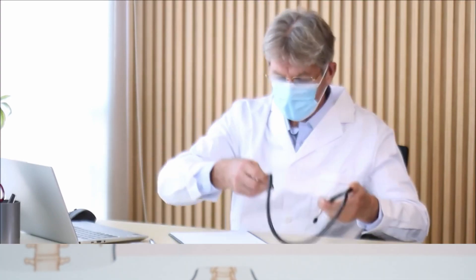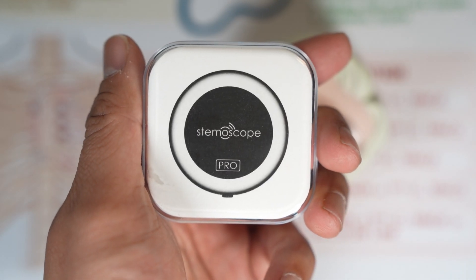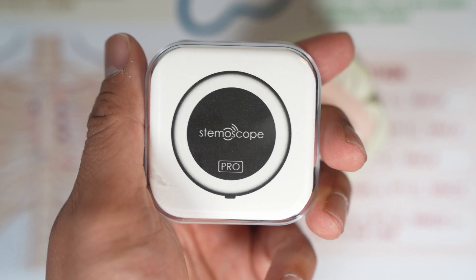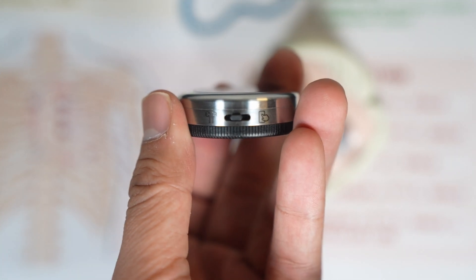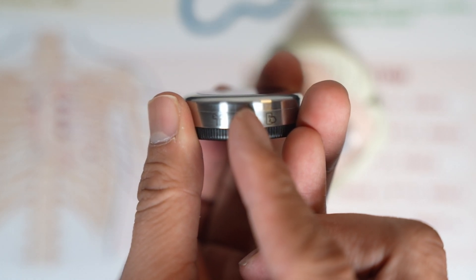Hey YouTube, let's talk about the Stemascope Pro. You can find it in the links below. The Stemascope is a medical grade stethoscope that has two settings to connect to your phone or Bluetooth earphones.